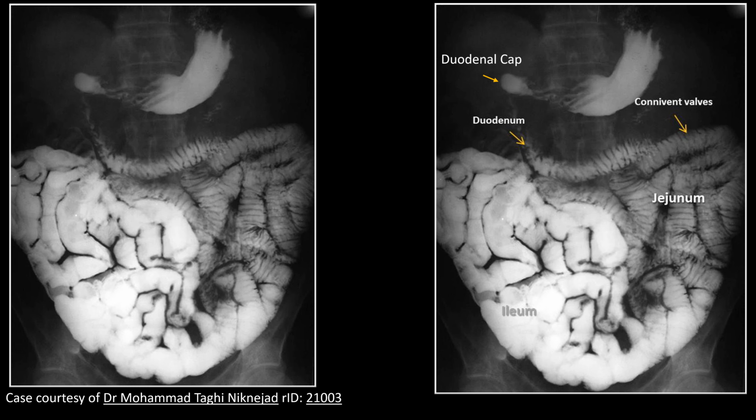These are the images of barium meal. When barium enters the stomach, it tends to form a triangular mass below the air of the fundus. It then descends as a narrow stream to the pyloric part of the stomach. In addition, the shape, curvatures, peristaltic waves, and the rate of emptying of the stomach can also be studied.